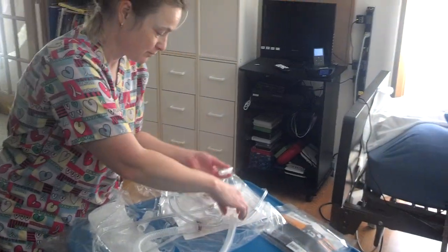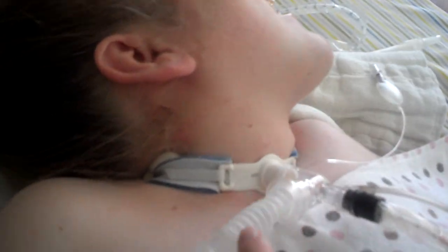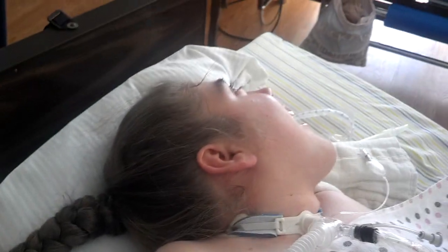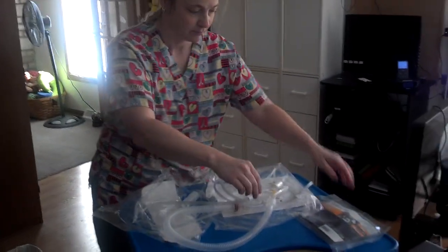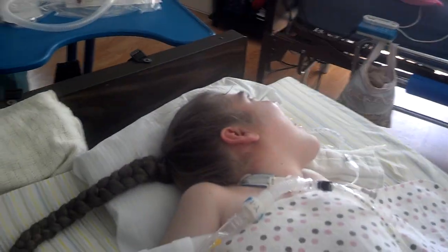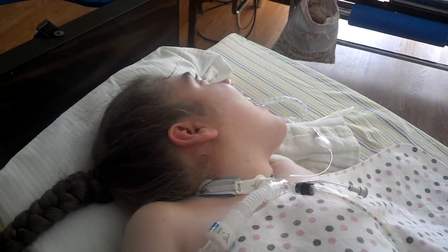There's the flex tubing connector, which is this piece on Taylor. It just gives you some wiggle room on the circuit without it pulling on a trach all the time. In the new age of me, we change it out daily. It's later in the morning so Taylor's had a chance to get a lot of her morning secretions out, which are a little thicker.